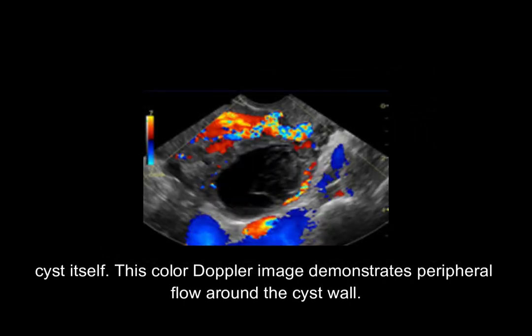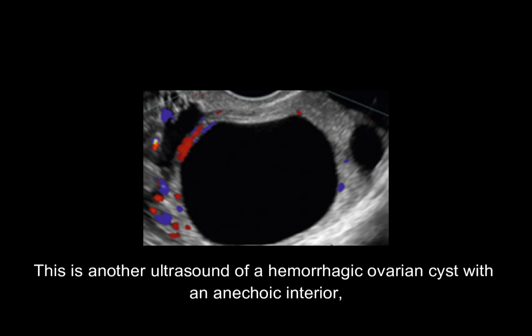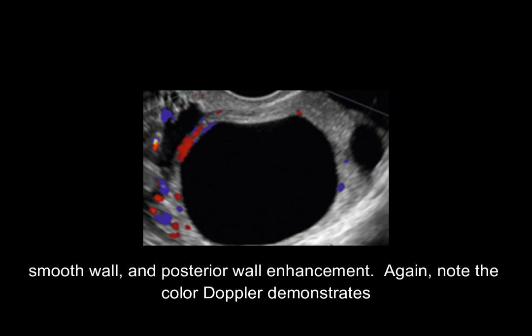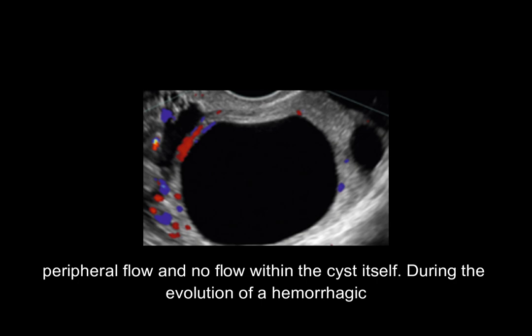This color Doppler image demonstrates peripheral flow around the cyst wall. This is another ultrasound of a hemorrhagic ovarian cyst with an anechoic interior, smooth wall, and posterior wall enhancement. Note the color Doppler demonstrates peripheral flow and no flow within the cyst itself.